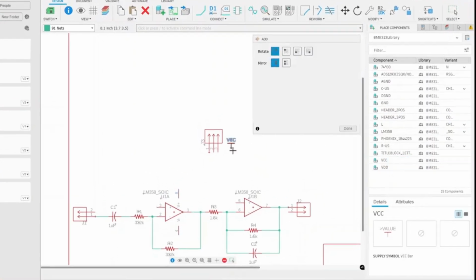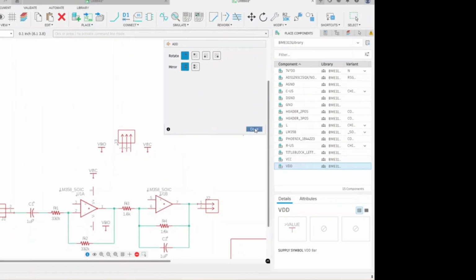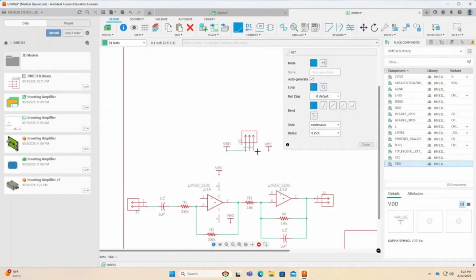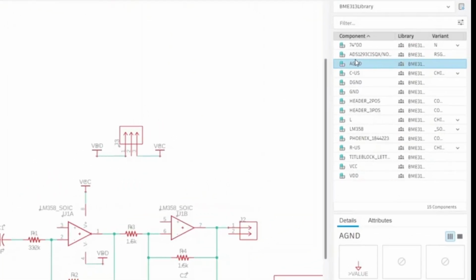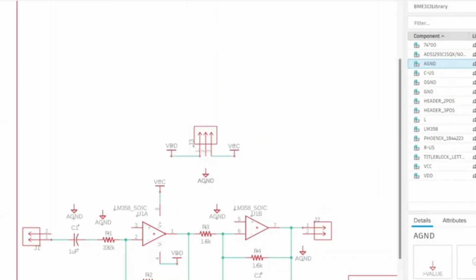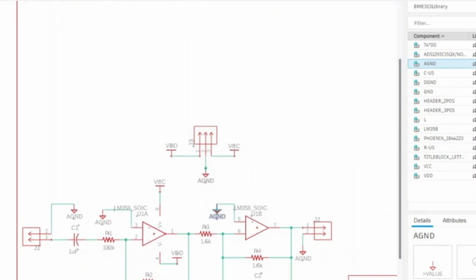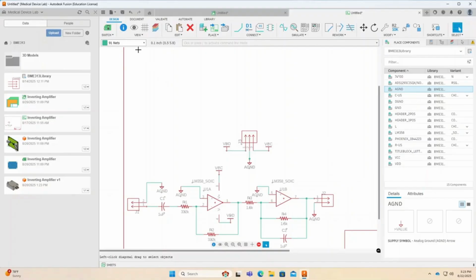Add the power supply symbols, VCC and VDD, for the positive and negative power supplies. Connect them to J3. Connect VDD for pin 4 and VCC for pin 8 of the op-amp. Finally, add the ground symbol and connect them accordingly. Once all connections are complete, make any final adjustments. The schematic is now finished.